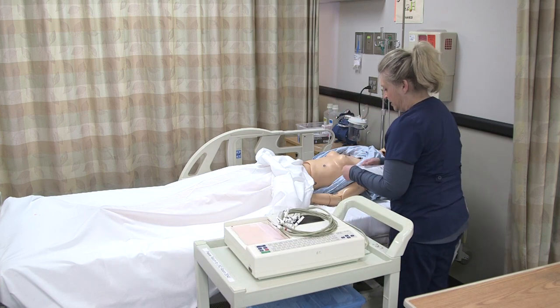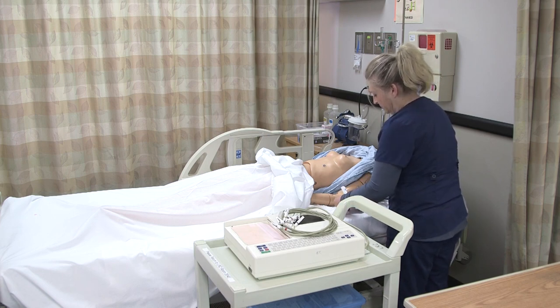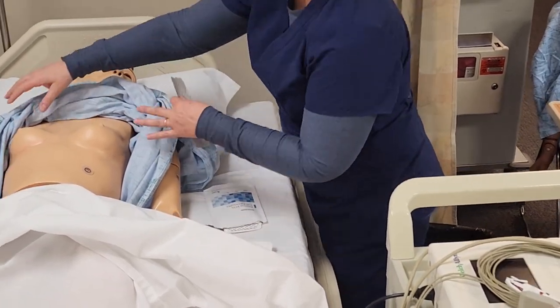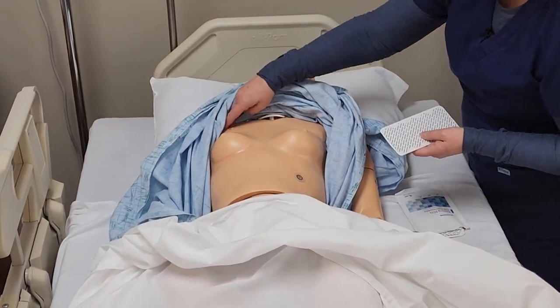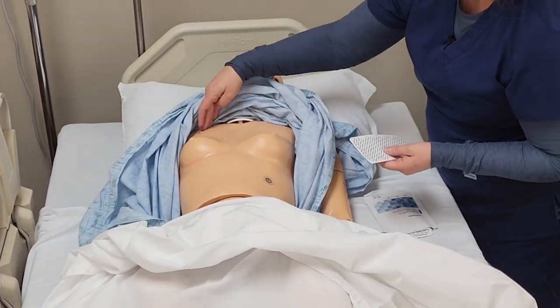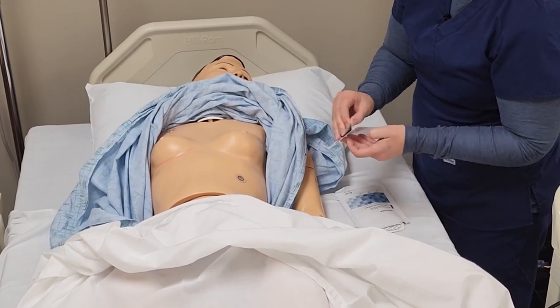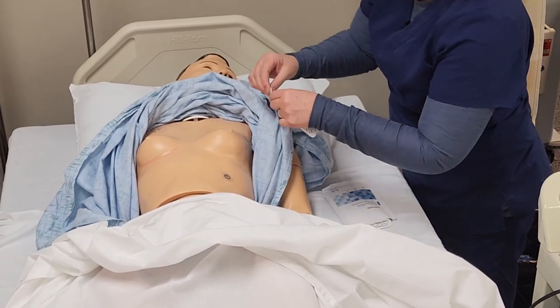Now that I have the patient in the appropriate position, I'm going to go ahead and access my electrodes. We're going to be placing electrodes on the right upper and the left upper, near the humeral joint at the shoulder.